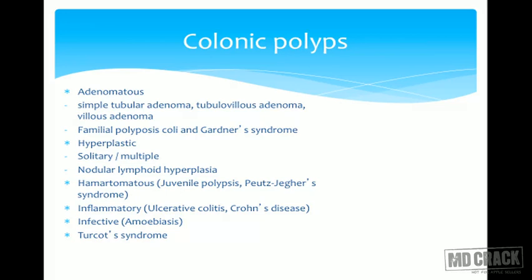But another way, although less frequently used, is virtual endoscopy. In this, what we do is we insufflate the colon with air, and then we do a plain scan, or we do a plain and a post contrast scan, and then due to post processing, we will be able to see the lumen of the colon.